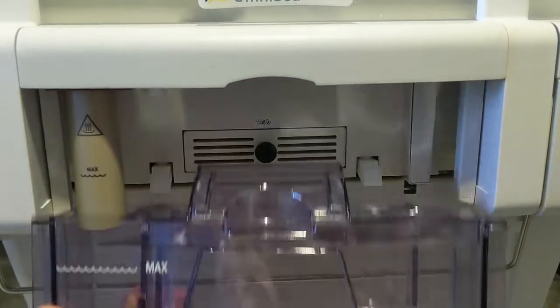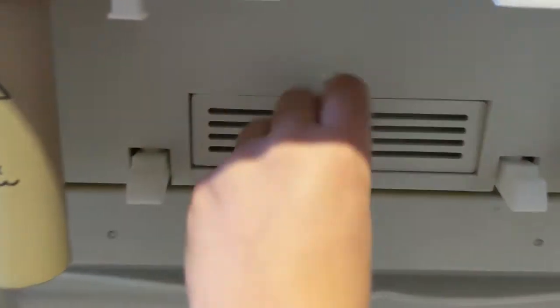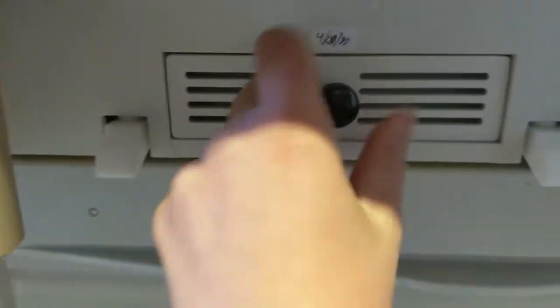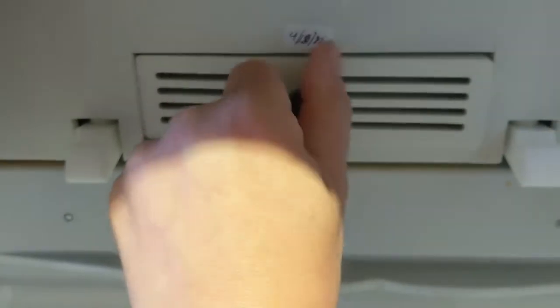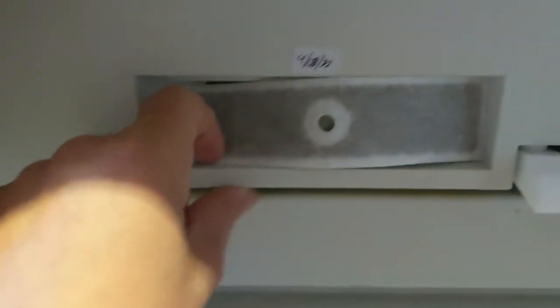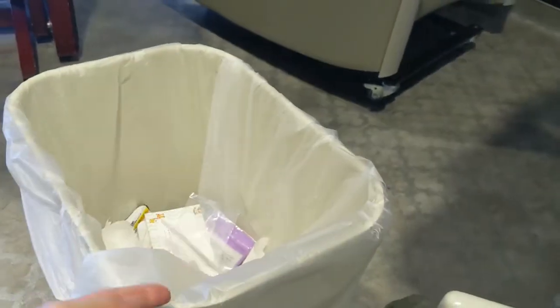Remove the humidity container. Unscrew. And remove this dirty filter. Just throw that in the garbage.